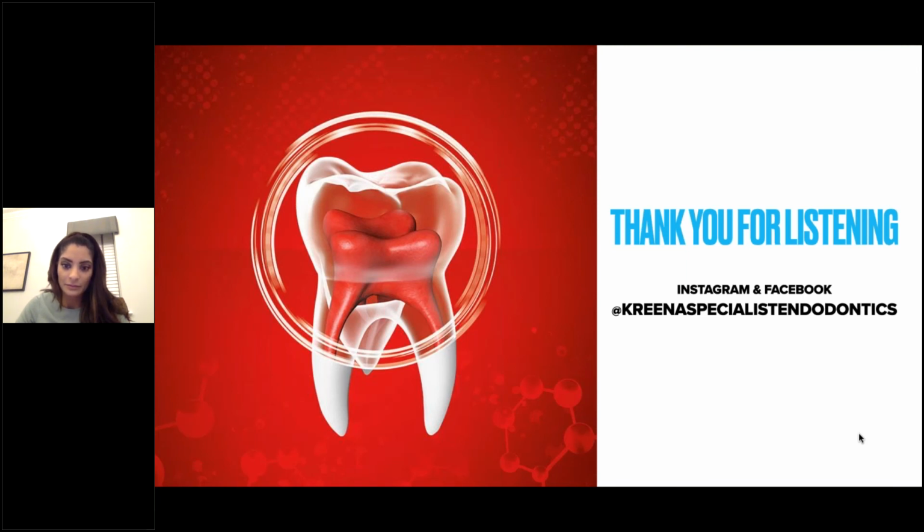Do you routinely use a collagen barrier for perforation repair? No, I don't. I don't think I've ever used a collagen barrier for perforation repairs, actually. I prefer to put the Biodentine down directly. I want to make sure that I have good hemostasis before, so I make sure that occurs, but I don't use the collagen barrier.